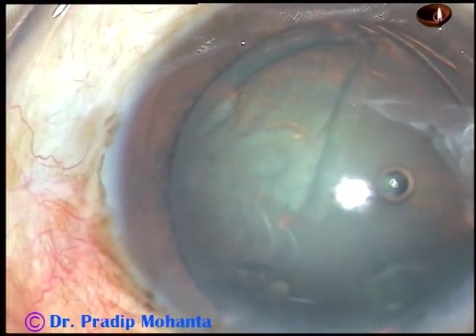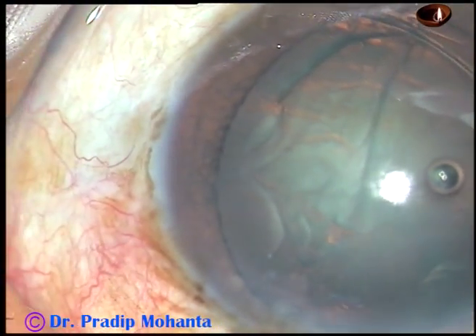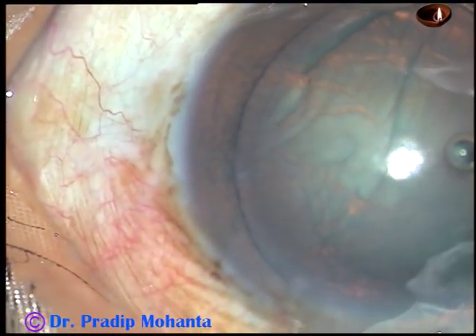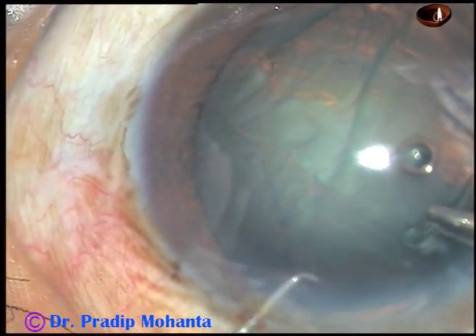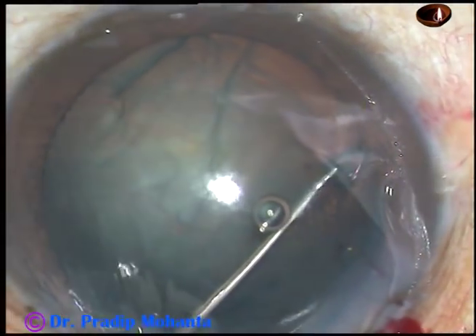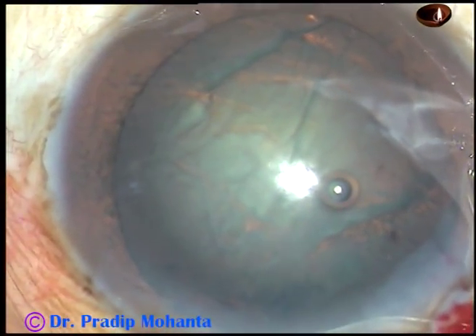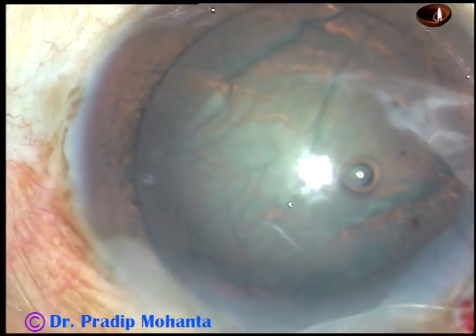Now I hold very close to the islet of the trailing end of this CTR with McPherson's forceps and introduce a Sinskey hook through the side port, then guide this CTR into the capsular bag. The CTR has now been placed — without hydrodissection.